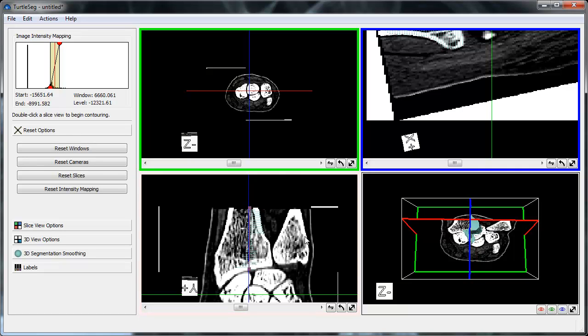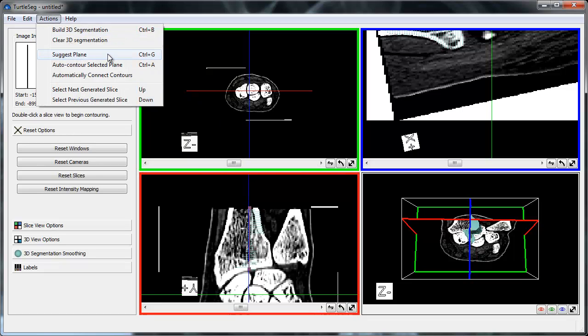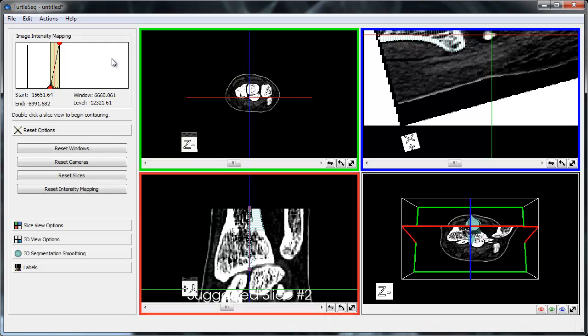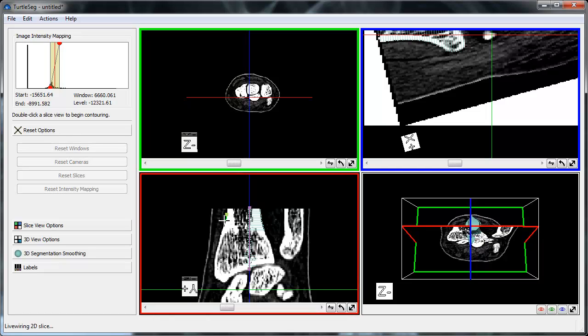If we are not satisfied with TurtleSeg's suggestion, we can invoke Spotlight again to obtain a new suggestion. In general, we can ask TurtleSeg to suggest a plane for us by selecting Suggest Plane from the Actions menu. TurtleSeg calculates a new suggestion, and we accept it simply by starting to contour the suggested slice.